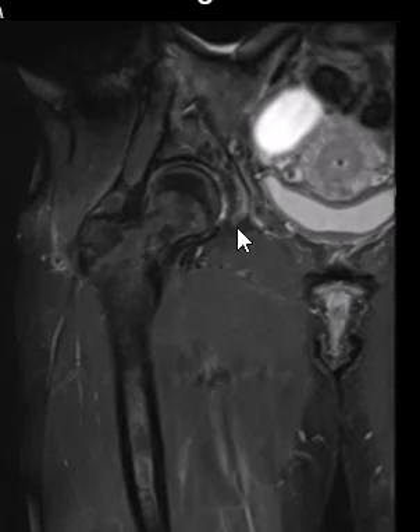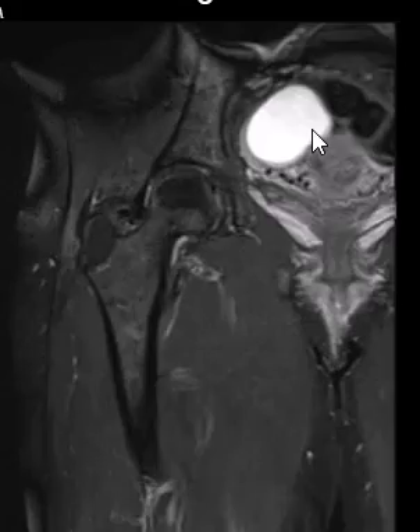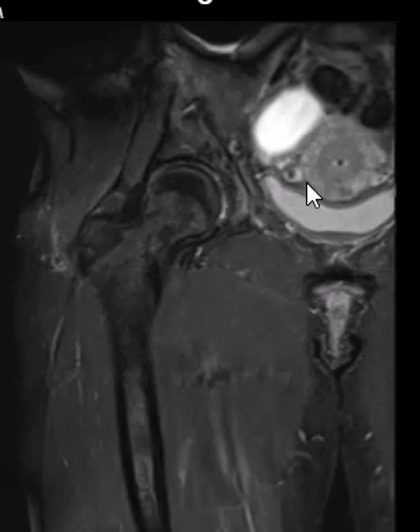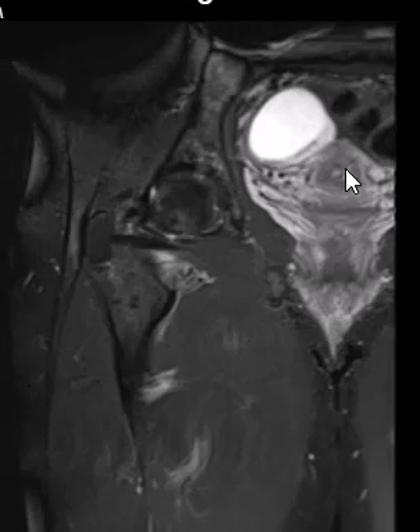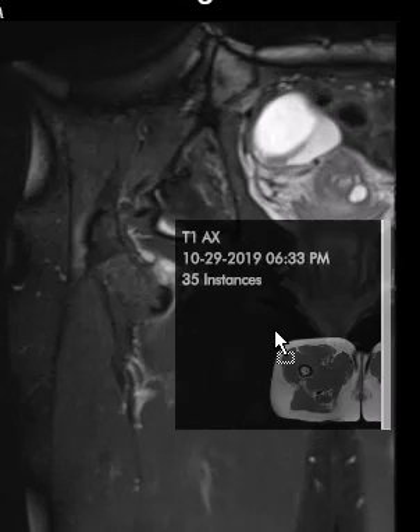Going to a coronal view on the STIR sequence, we see the bright cyst and another cyst right posterior to it that is not quite as bright. This fluid is brighter than the bladder. Here is the urinary bladder, here is the uterus, and there is a small IUD in nice good position. Now we'll put on a T1-weighted sequence to evaluate further.